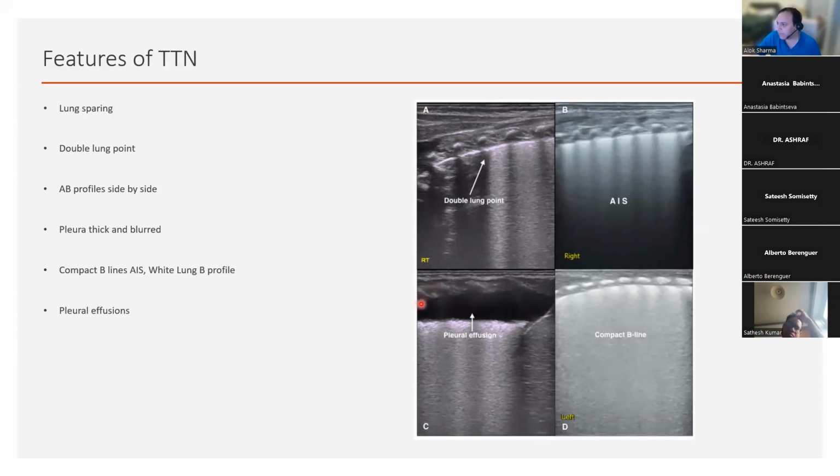Again, from my perspective, there'll be an element of lung atelectasis because the lung is compressed. So an effusion would always be fluid between the visceral and parietal pleura. Thank you. Yeah, hydrothorax would be used interchangeably in the UK to describe that. I don't tend to use that terminology.